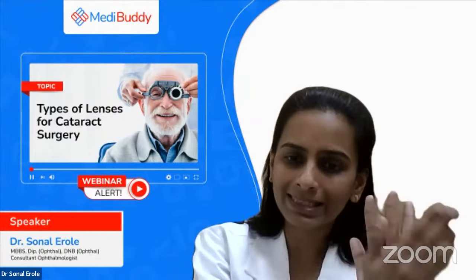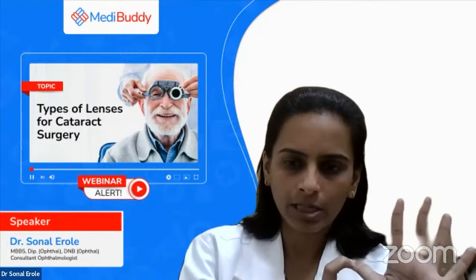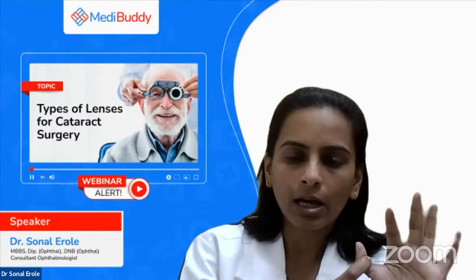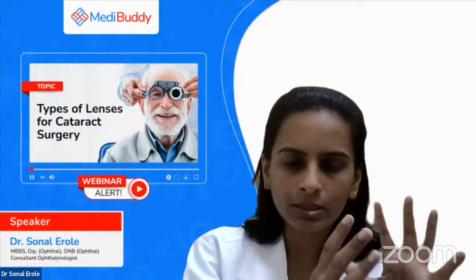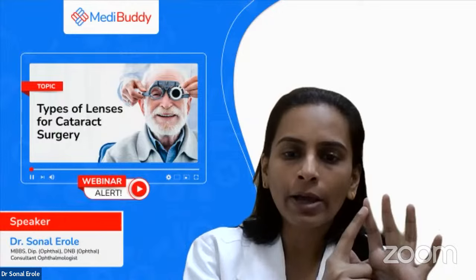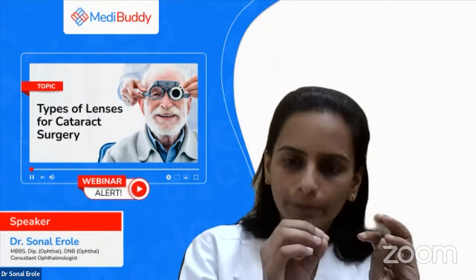Sometimes we help the patient to choose according to their active life. But sometimes the patient has diabetes or some problems in the retina. For these patients, if they have any problems in the retina, we advise them to please go for the monofocal lens. Why? Because to have multifocal or extended depth of focus lenses, you need to have all your other eye structures, including the retina, in perfect position and perfect health.